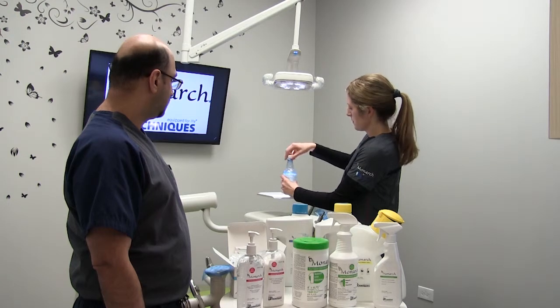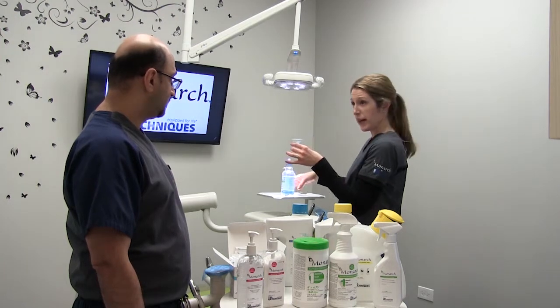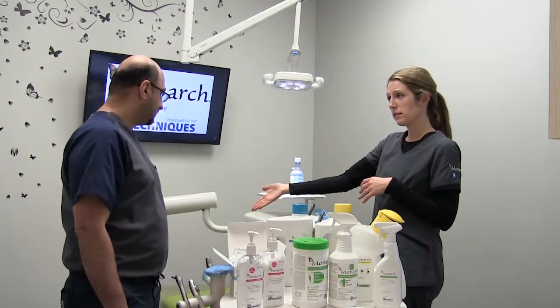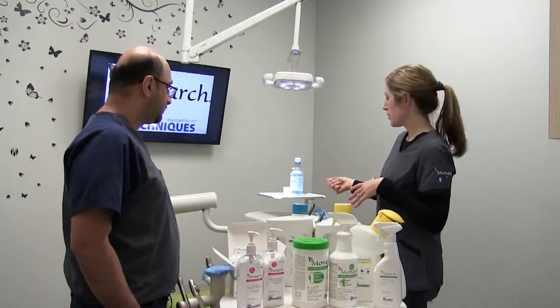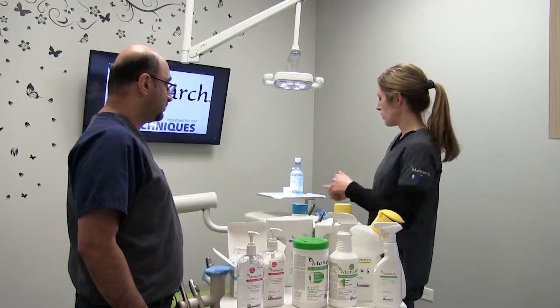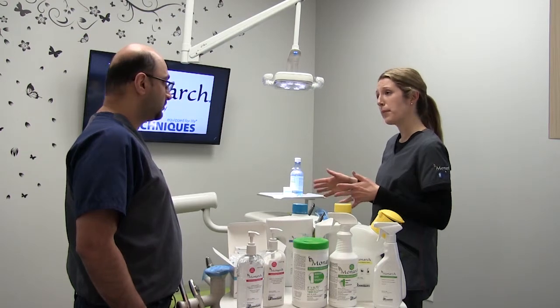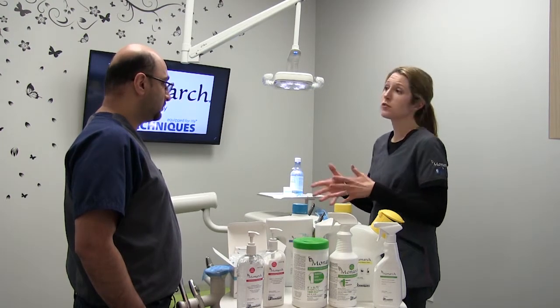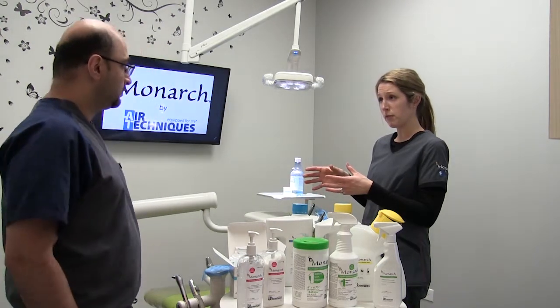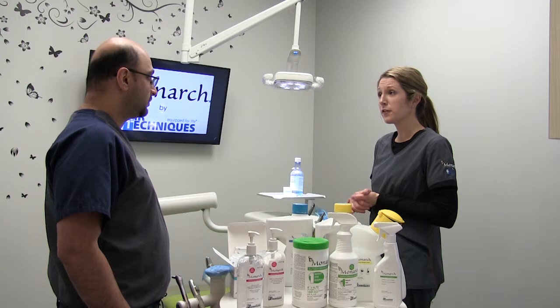You measure two ounces in the measuring cap. You would then take your bottle off the unit, dump out the water, and purge your water lines. Then pour the two ounces into your bottle and run your high speed and your water lines. When you start to see the product come out, stop. Ideally leave it sit for 24 hours — over the weekend is fine. When you get in on Monday morning, take the bottle off the unit, dump out the remaining amount, fill the bottle like you normally would, and you're ready to see your first patient.